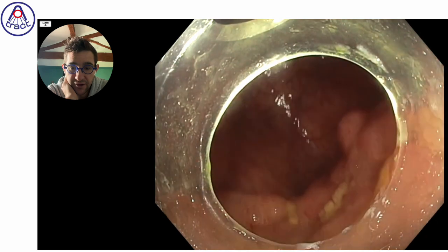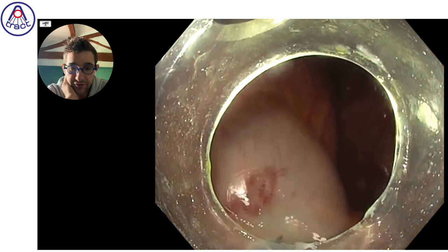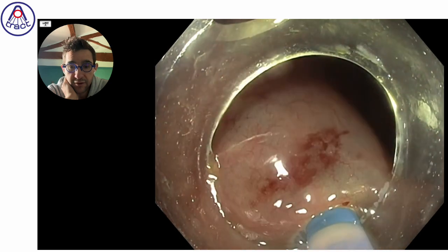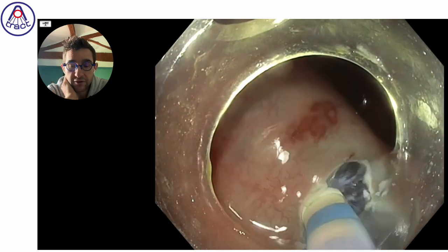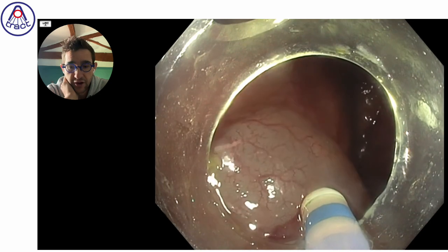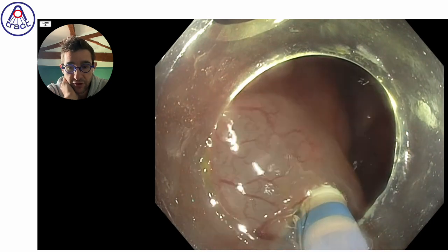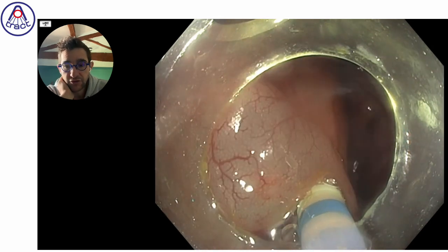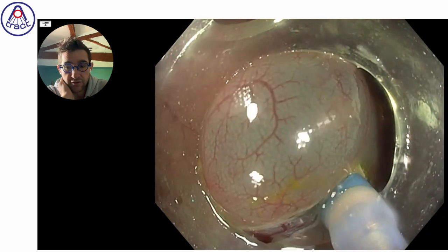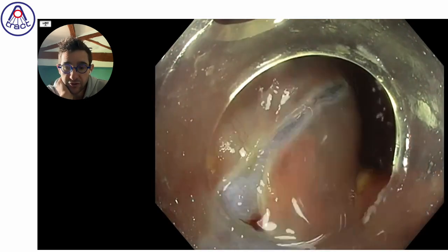You can see here, it is quite impossible to see my first incision. So really, it is an important point. I should have done all the oral edge incision first before injecting at the anal side, because it makes my resection and incision a little more difficult.